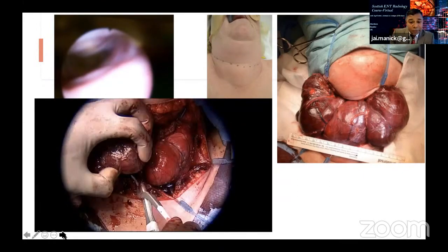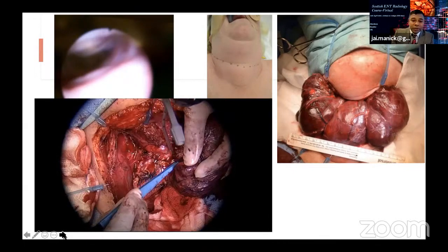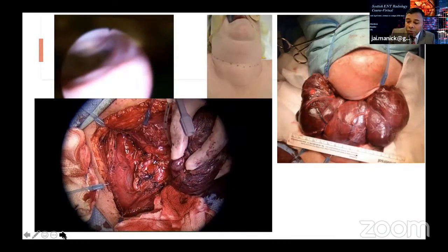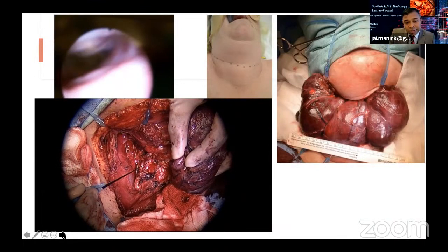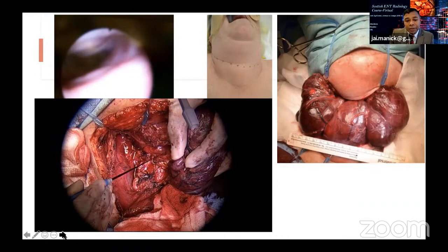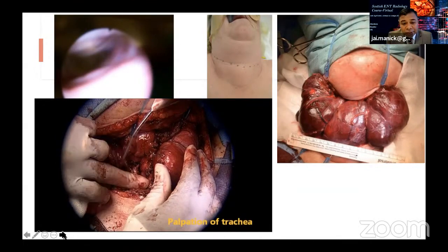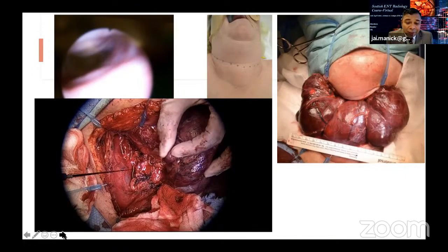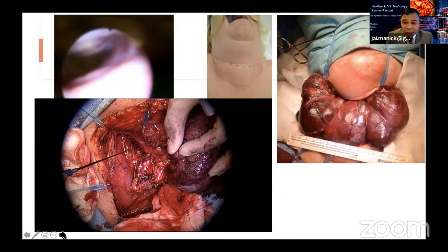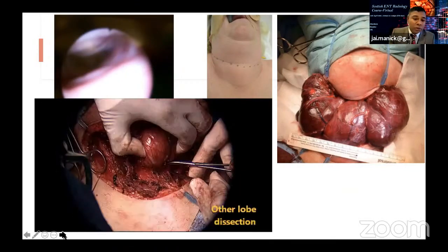And the last but not least for this case is about the trachea. We talked about tracheomalacia. During surgery, you can see how soft the trachea is, and that predicts whether this patient can be extubated in the theater, or maybe electively extubated in the intensive care unit, or in very rare cases, they may need a tracheostomy. But in my case, I never had anything to that extent.